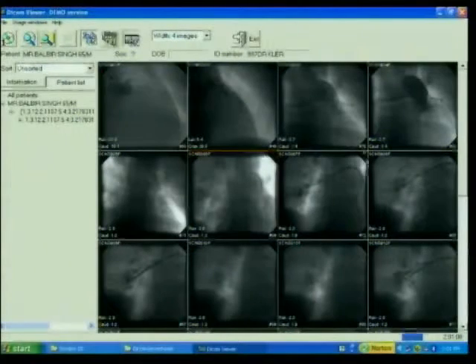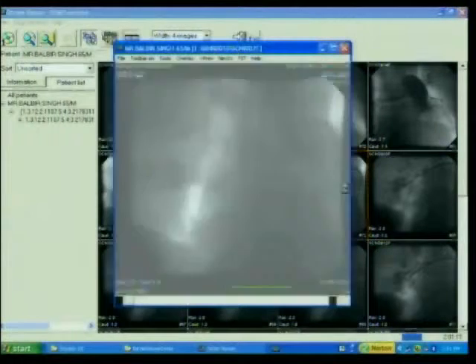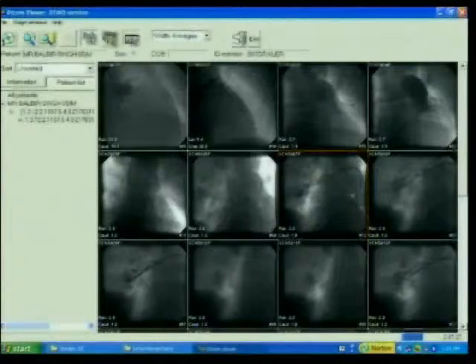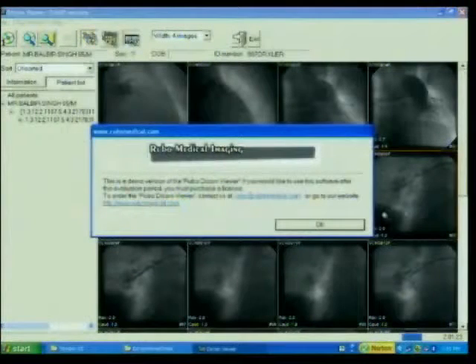So what is it that we are seeing? It's an Export or something? No, this is a Possis AngioJet catheter. This is the Possis AngioJet which is going into the right main pulmonary artery, and we advance this catheter into each of the branches and declot the artery as much as possible.